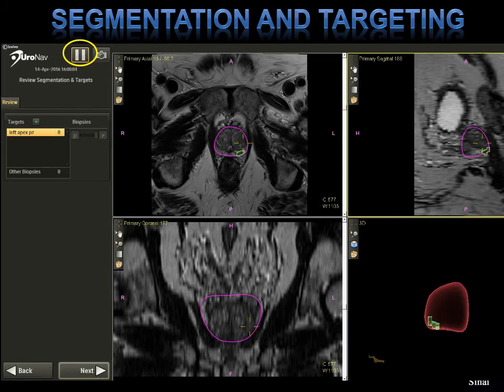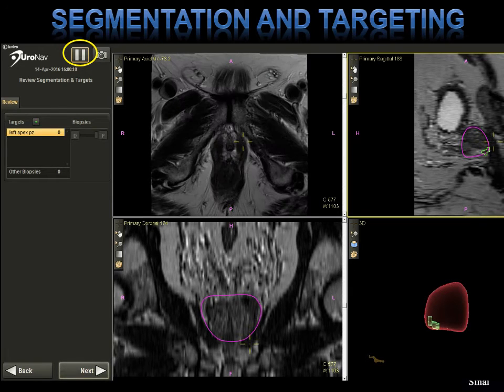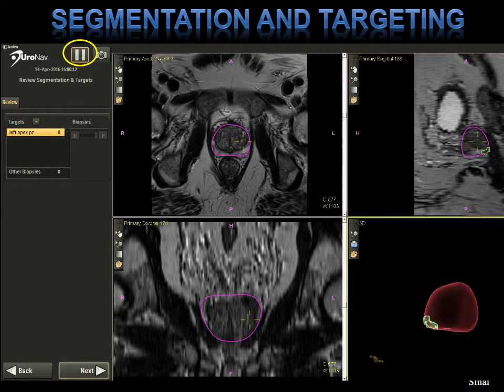After you hit record, scroll through and check your MRI segmentation. Where are the targets in relation to different anatomical structures within the prostate? You're able to see the 3D representation in the lower right-hand corner of the screen. Also, patients sometimes find this helpful when looking at it in the office, to see the areas we want to sample in context to how large the prostate is.